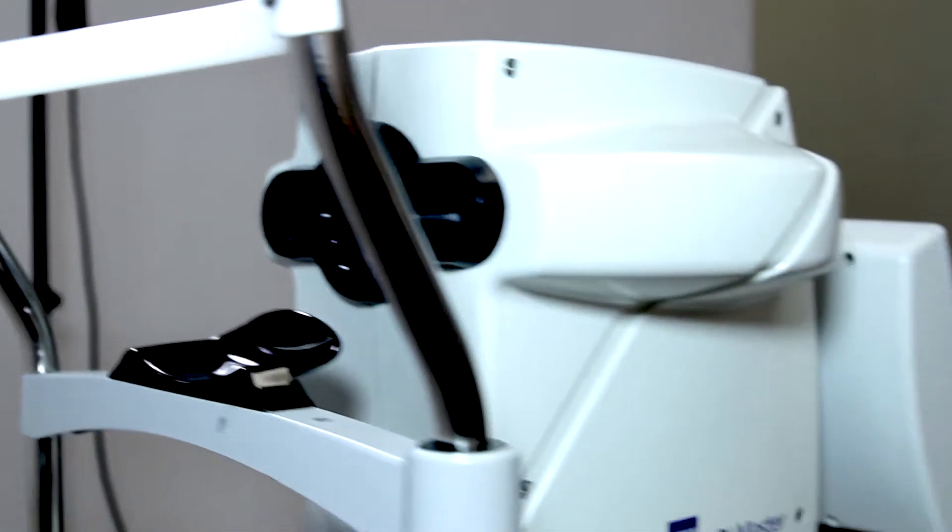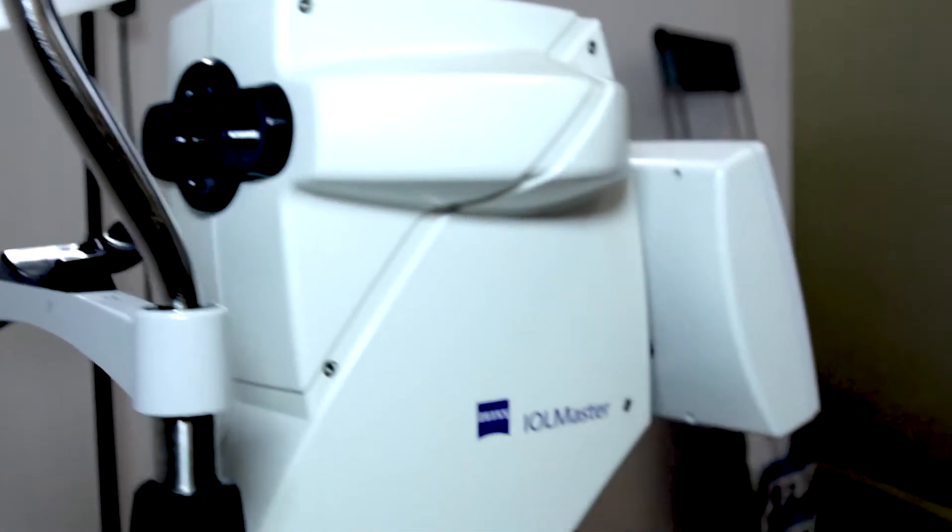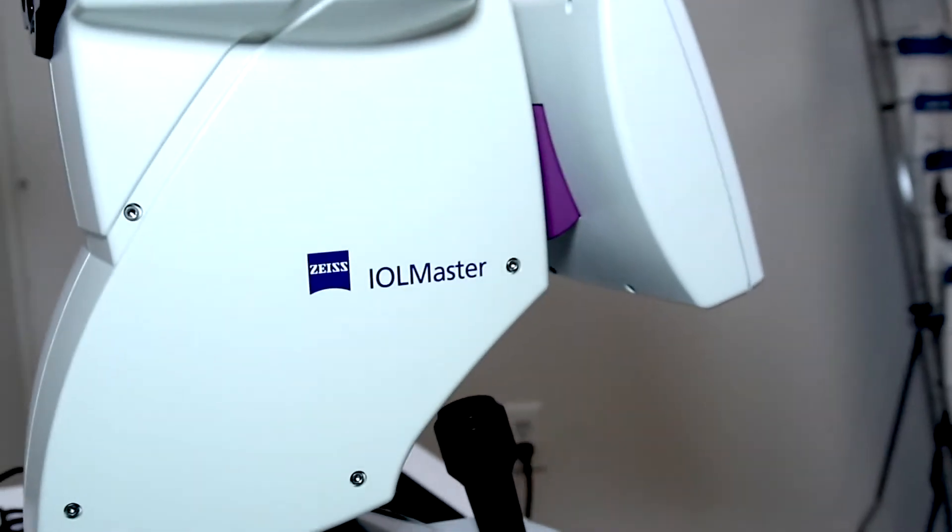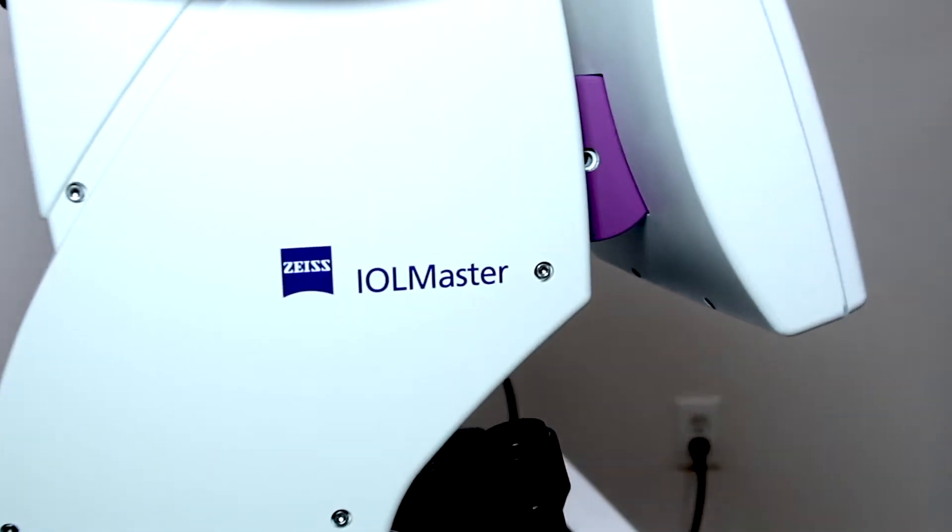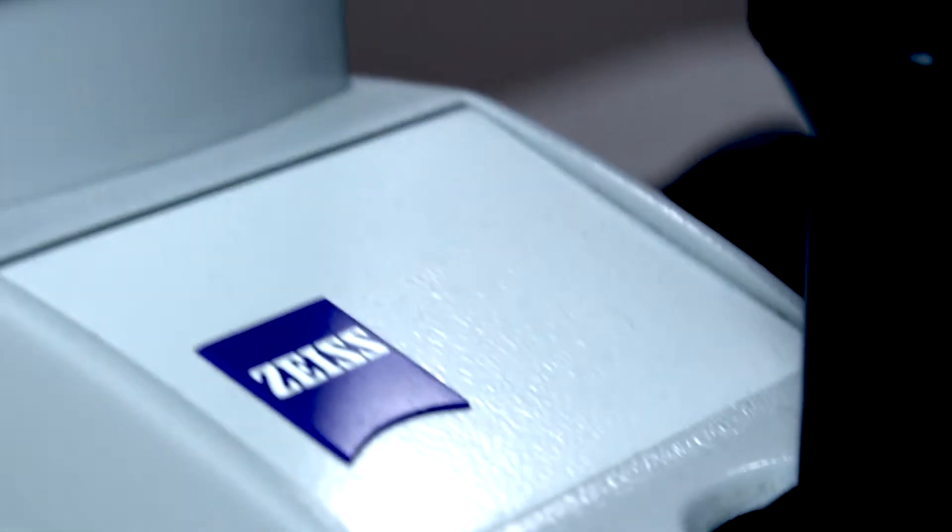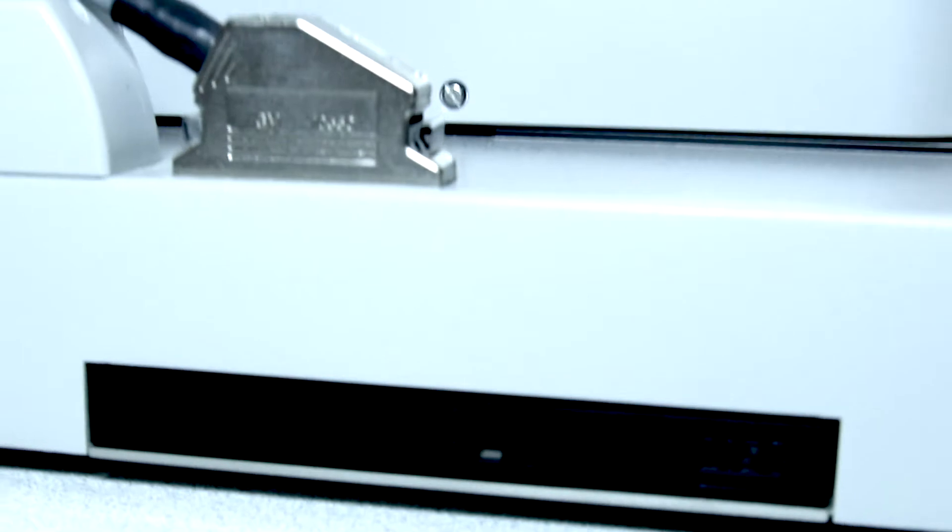These measures allow for using the most suitable lens for each patient and have proven to be five times more accurate than traditional technologies.